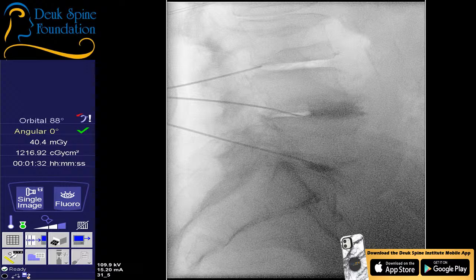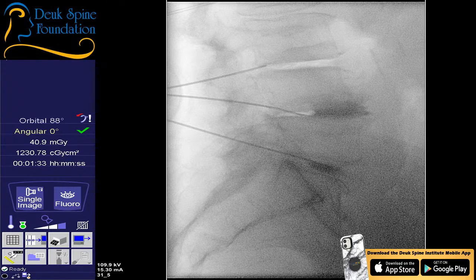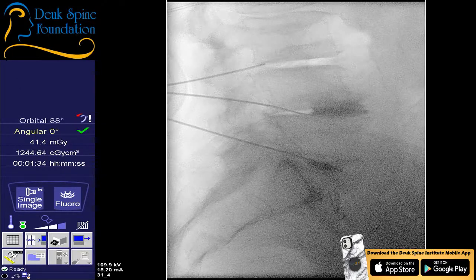Alright. So at this point we're going to take the needle out and leave the guide wire at 5-1. Shot. Shot. So I want to advance the guide wire. There it is. Okay, you're locked down on fluoro? Yes, sir. So the guide wire I could see at the front of the disc. I'm taking the needle out. Shot.